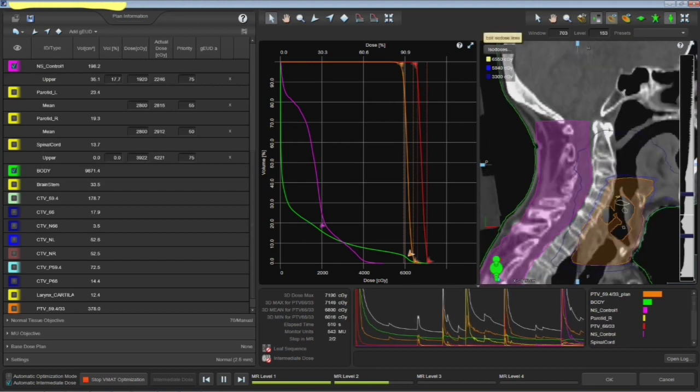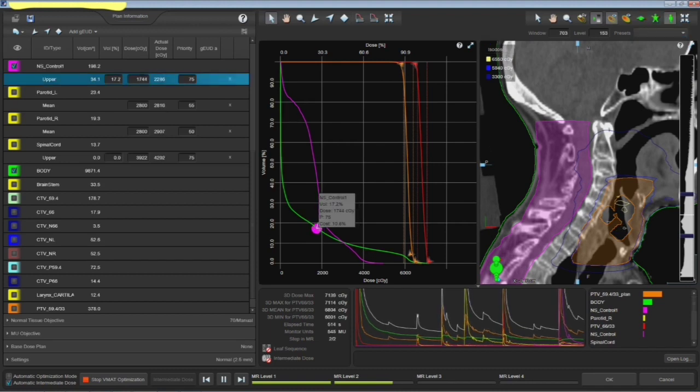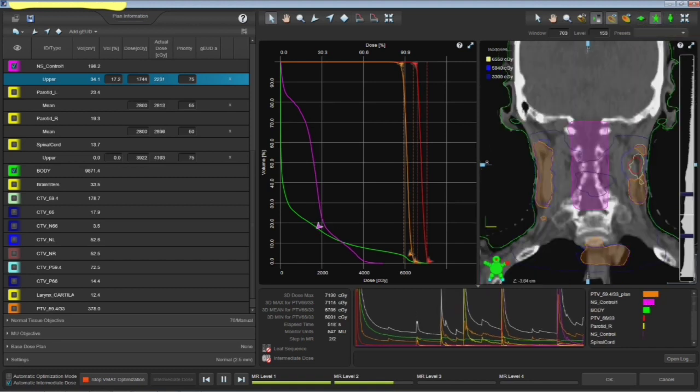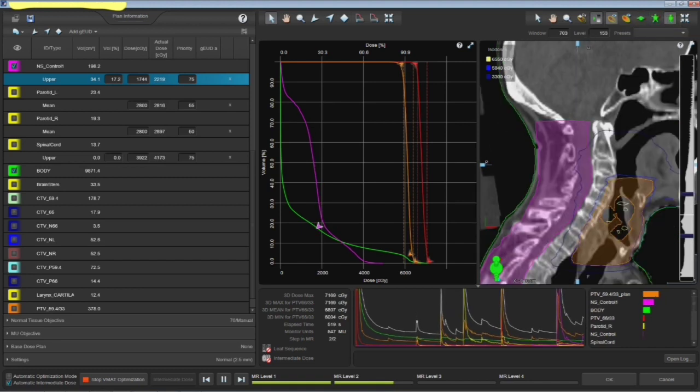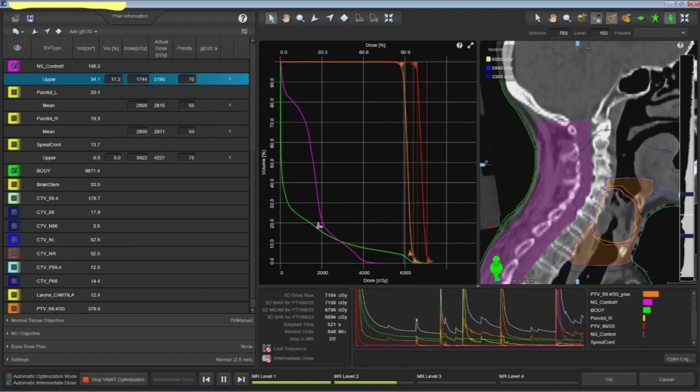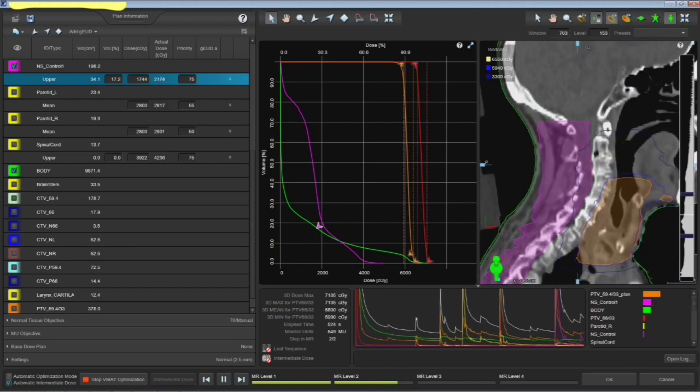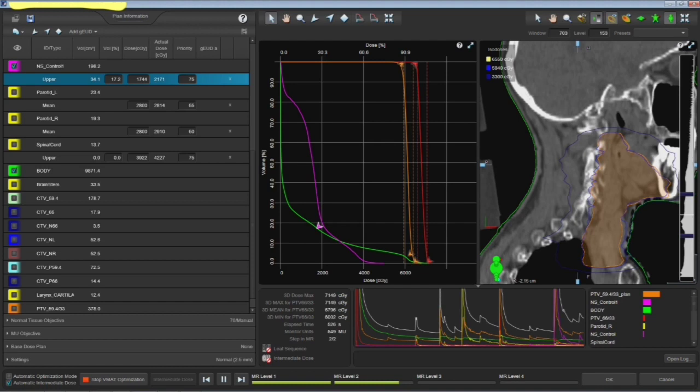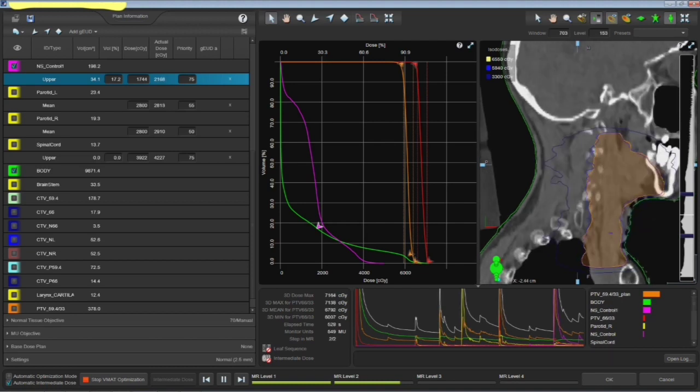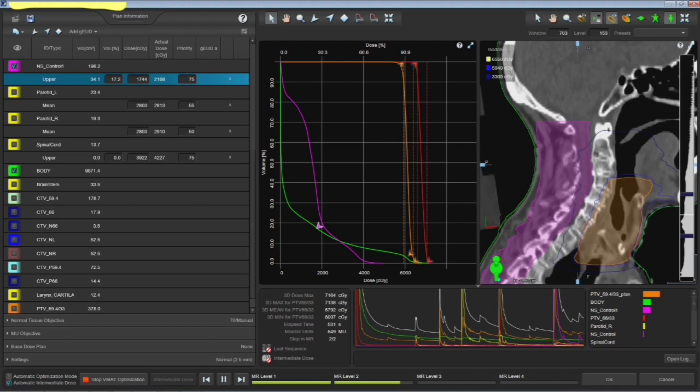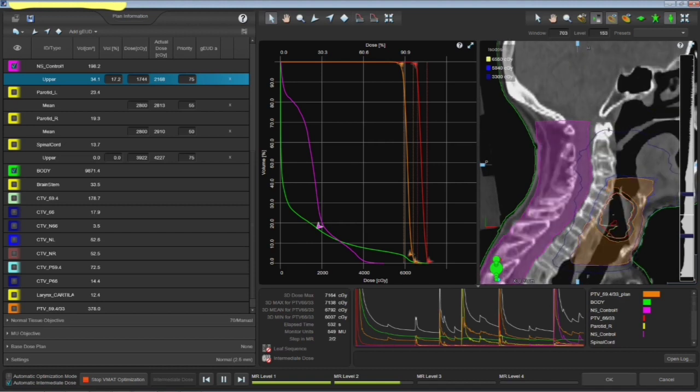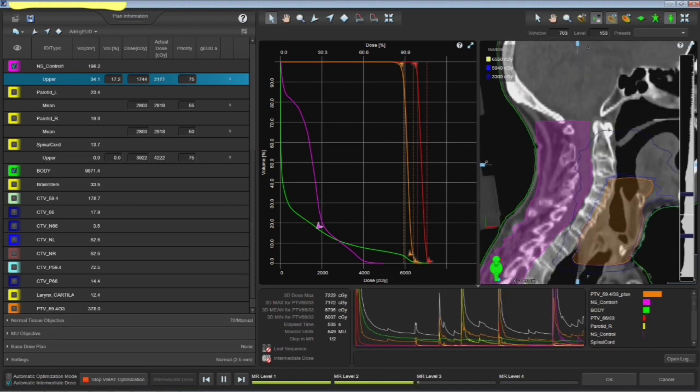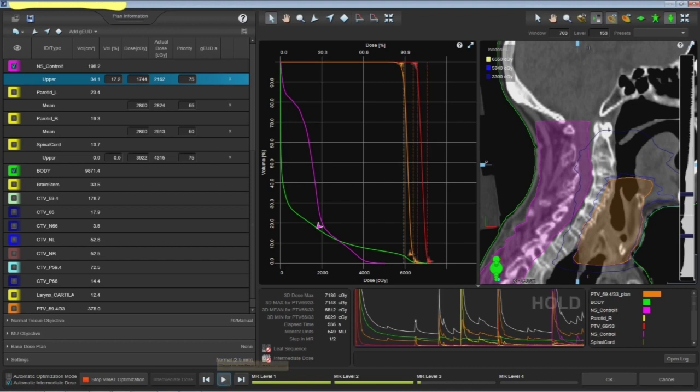You can clearly see that in the sagittal. One has to be very careful actually because by not allowing that 50 percent curve as it was curved onto that, you should not underdose as well the targets. So that is where the compromise things happen.